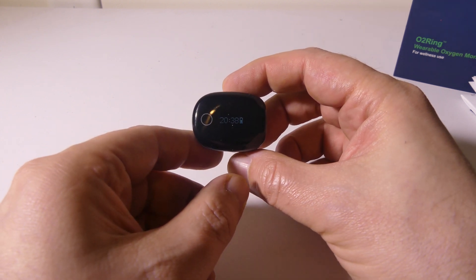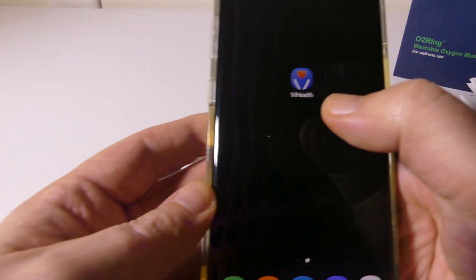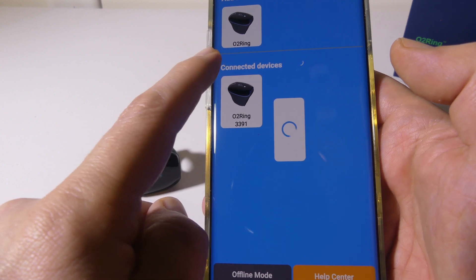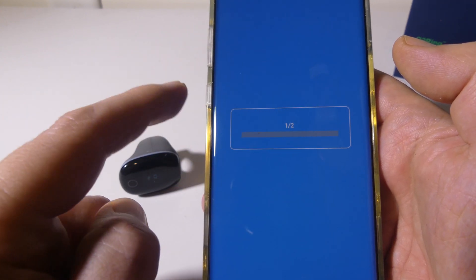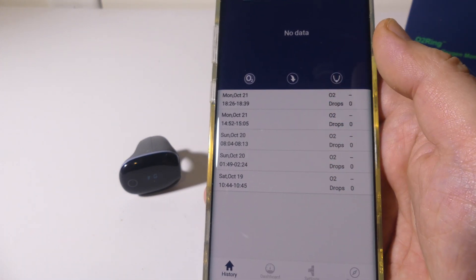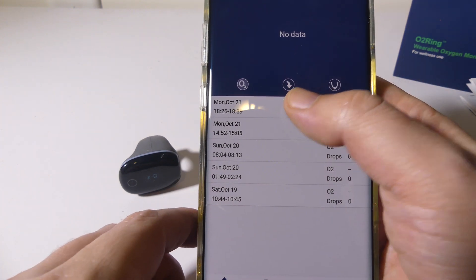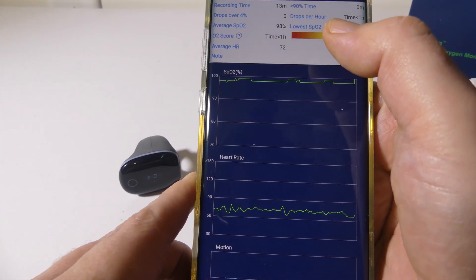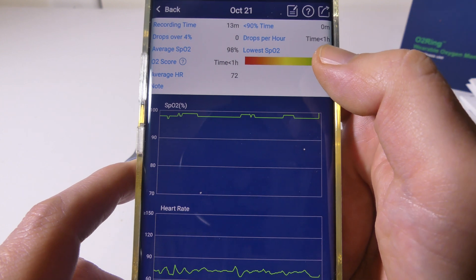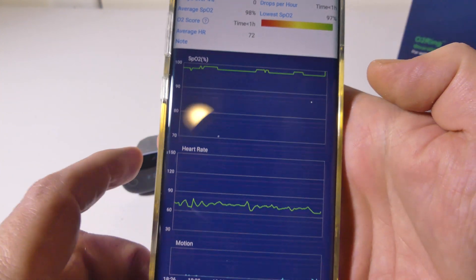It uses Bluetooth 4.0 Low Energy, so it'll hook up to any iPad or iPhone. You can use the vHealth app, which is great — my connected device is already set up. If you don't have one paired, it will automatically try to connect. Looking at session data, it tells you how many O2 sat drops you had under the threshold. In a 13-minute session, my lowest SPO2 was 97%, average SPO2 was 98%, and average heart rate was 72 BPM — all displayed in a graph.